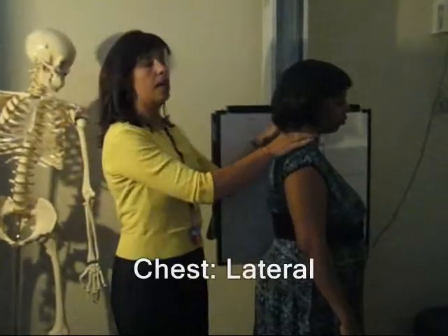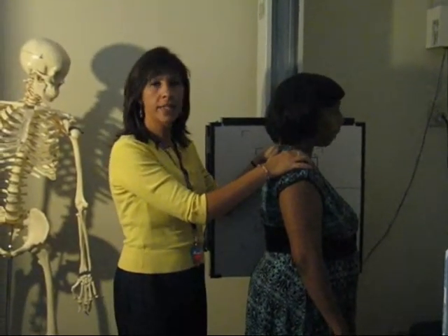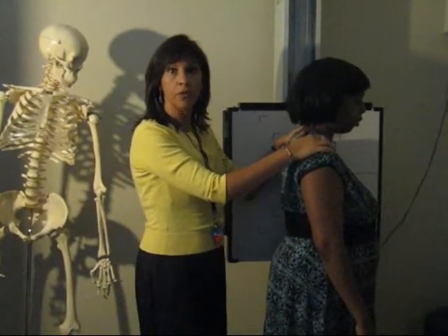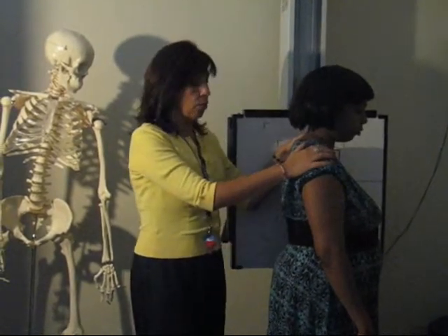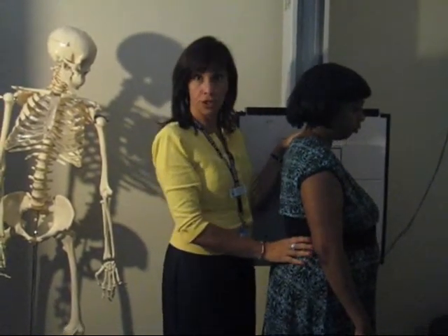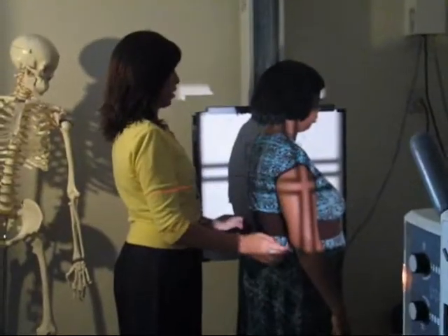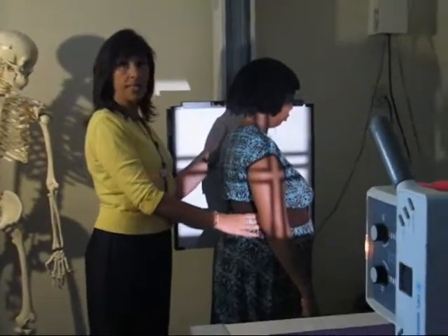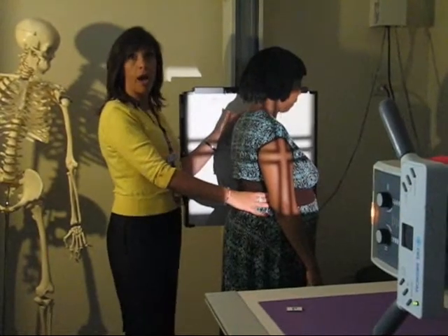All right, next on our routine views of the chest, besides the PA, we should do a lateral. For the purposes of this video, we're going to assume the patient has been shielded and that markers have been placed. We are going to place our patient with the left lateral side closest to the IR.